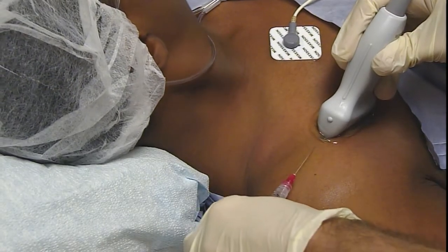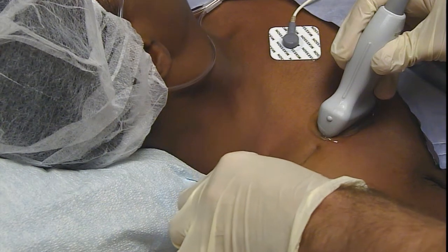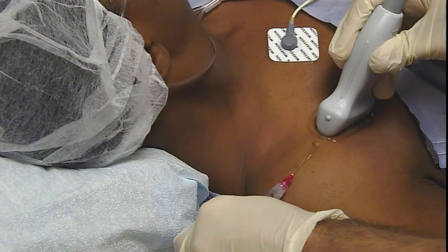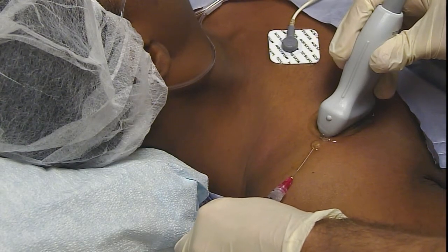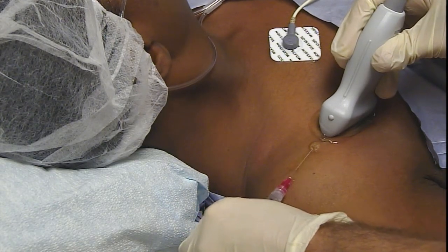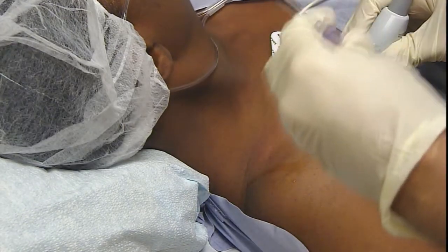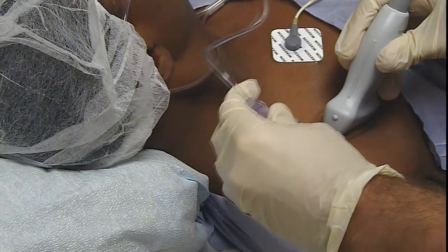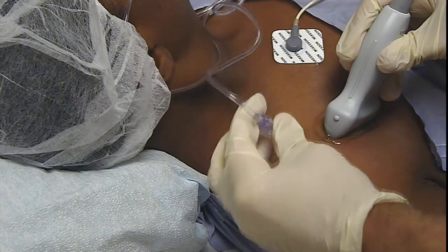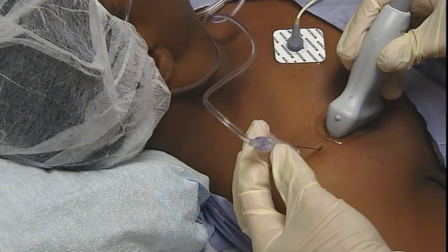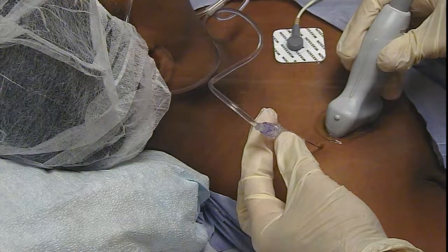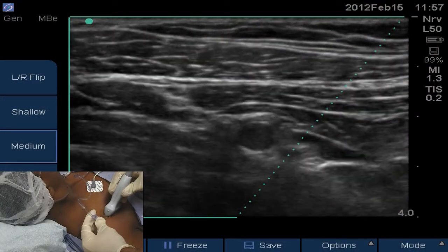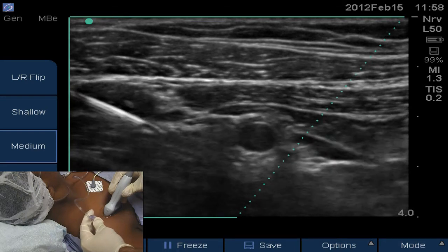You're going to feel a big bee sting — big pinch, big sting. I'm sorry. You're going to feel a lot of pressure. I can see the needle approaching very brightly from the left side of the screen there.